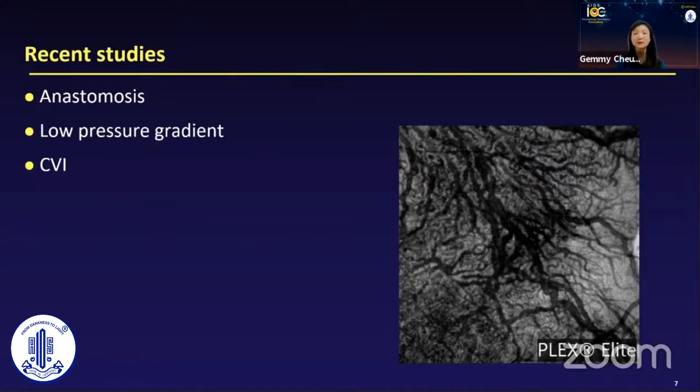We know what the descriptive features are, as mentioned, but still we don't understand what led to these. Dr. Atul mentioned the concept of choroidal congestion, which seems to be something that we're looking more and more towards. First of all, using OCT and OCTA, it is great. We can look at these large choroidal vessels non-invasively, and most papers generally highlight these changes within the macular region, as you can see in this example.